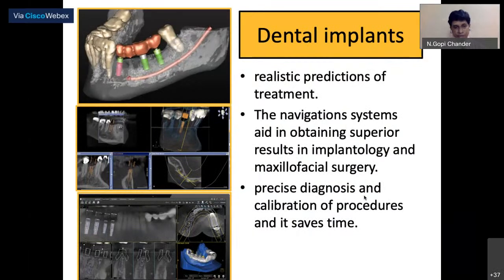In terms of dental implants, conventionally we make a radiograph, check the path of the nerve, position the implants, and all that is very difficult at the analog level. Next came the 3D scans, CT scans, which helped in differentiating various layers. Now you have very simplified options.